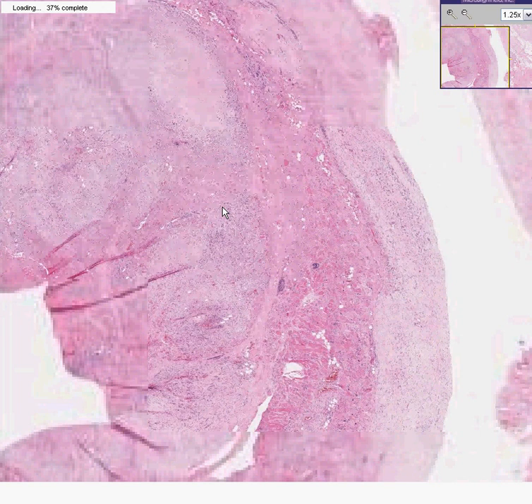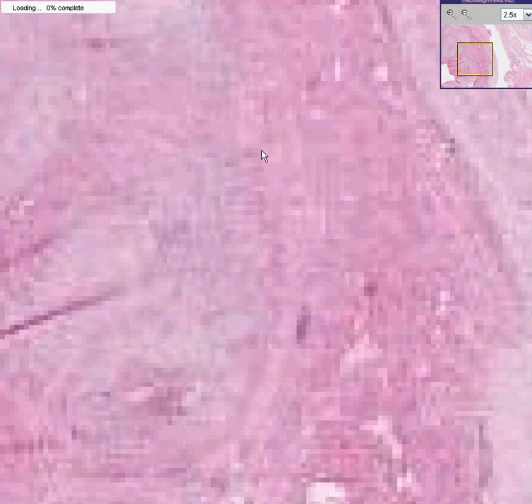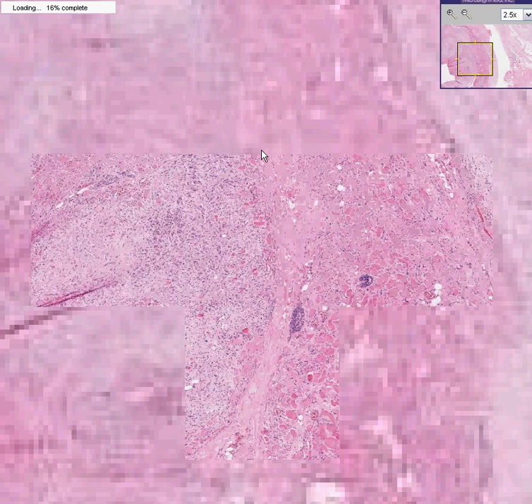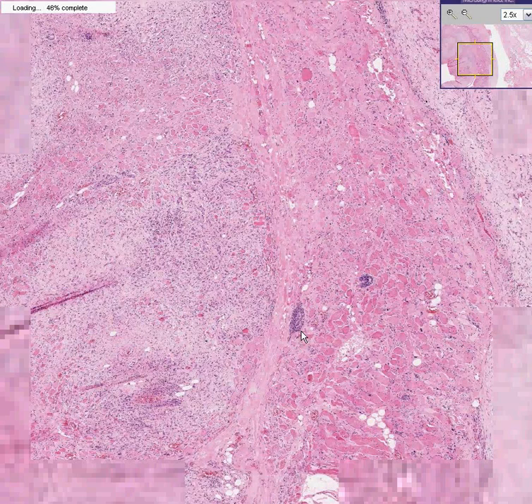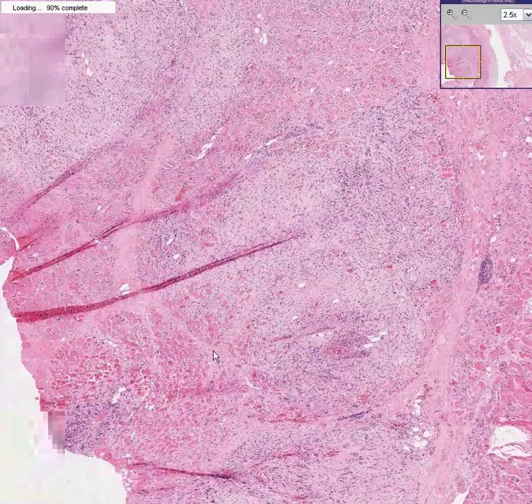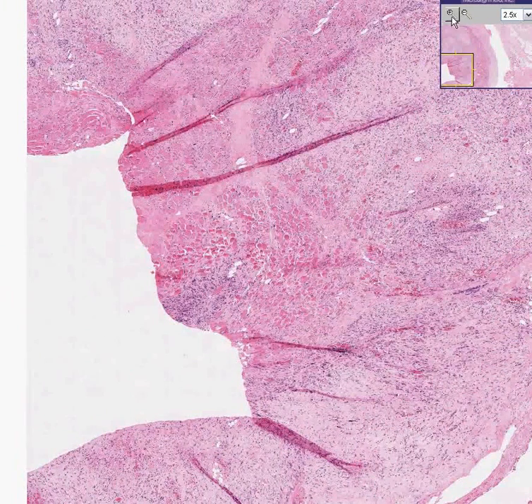Sometimes the cells are so small and subtle, you kind of miss it and you think, where's the tumor and why is the stomach wall so thick? But actually the tumor is very intimately dispersed, often as individual cells and sometimes as small nests like you see here and here throughout the entire thickness of the stomach. Let's zip it a little bit on higher power and go from the luminal aspect to the other aspect. This may not be a perfectly oriented stomach because I could see smooth muscle here as well, but it is more or less the full thickness of the stomach.